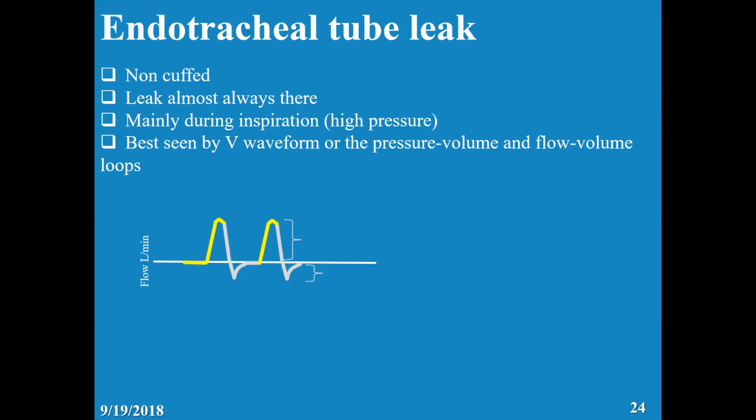Now when there is a leak, remember the principle: it always has to come back to zero, correct? The other principle: the in has to equal the out.